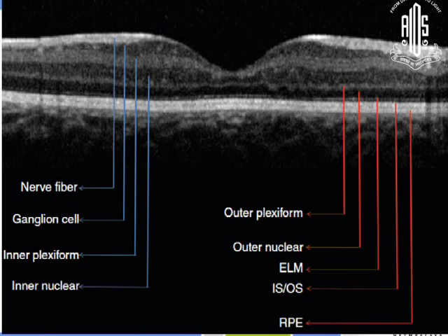The second important layer is the external limiting membrane, the lightish gray one there. Then I'll go back to the adult again. You see this foveal tent. The inner segment, outer segment, which is the whitest line here, has a little bit of a hump there and a little more blackened area there. That's because of the longer cones. The cones actually have longer cilia at the subfovea, and that's what pushes this up.